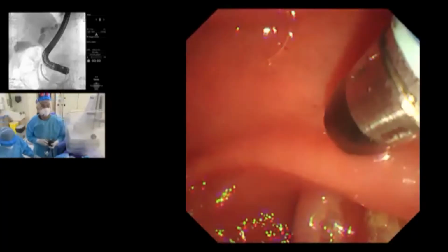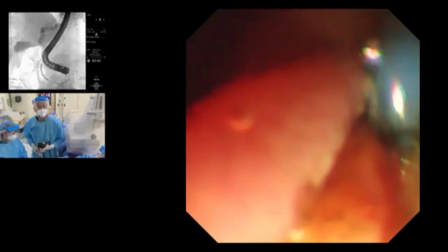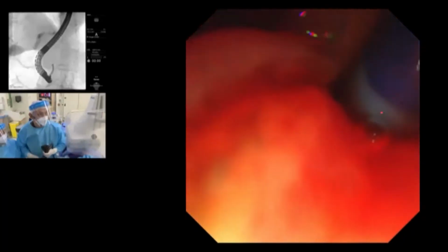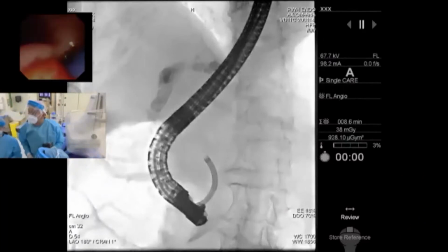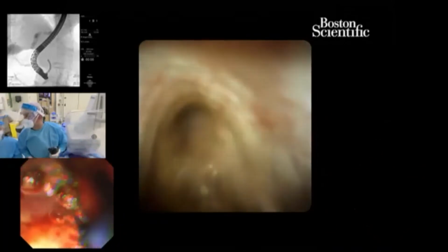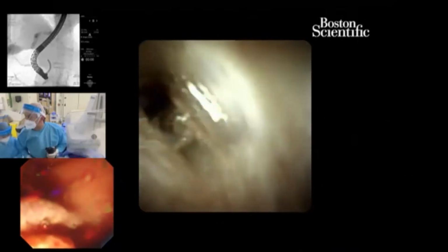All right, I'm going to try to cannulate with the Spy. Oops, okay, it's going up well. Looks good. Okay, I'm going to go freehand this time, listening to you guys. We change back to the Spy. Stop suction, please. Turn off the alarm.